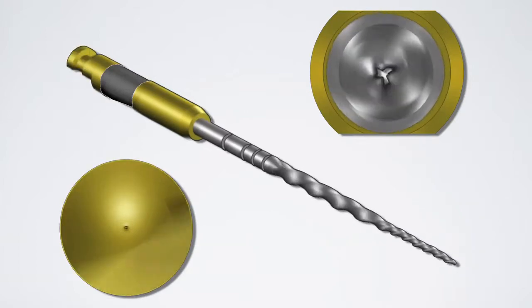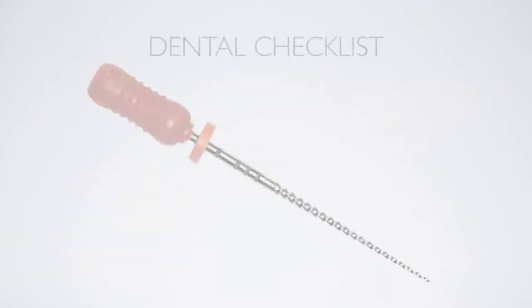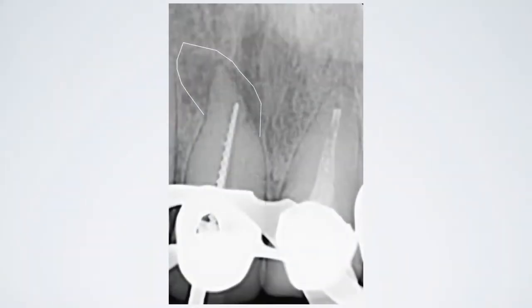To make sure I have the proper apical stop and canal shape, I use a shape verifier. This allows me to determine what carrier size I will use for obturation. I reconfirm this with a radiograph. When I take my check film here, it can be seen that the lesion extended even more initially than is suspected. Therefore, irrigation will be crucial to the success of this case. As you can see, once you get to working length, the final shaping is a breeze.